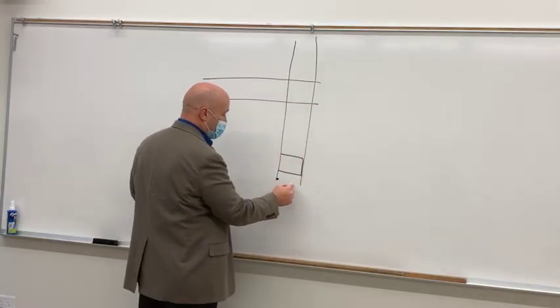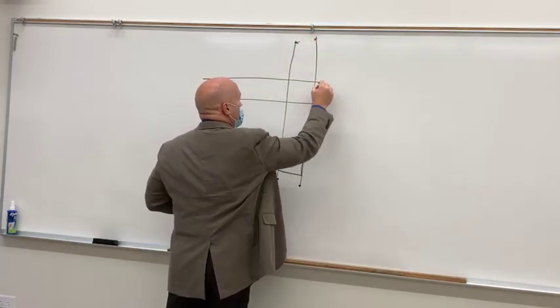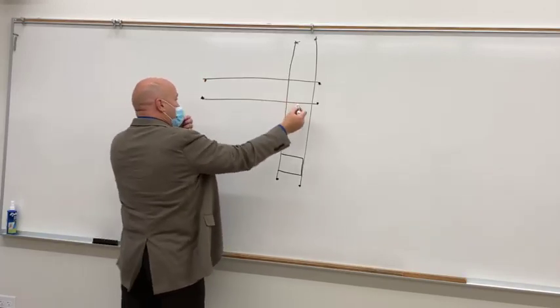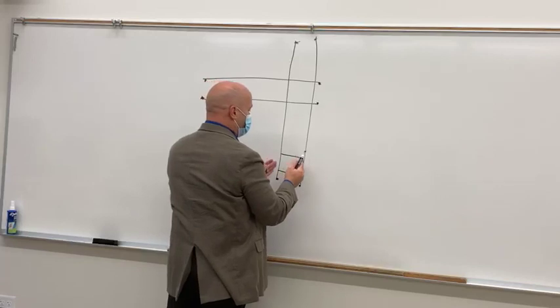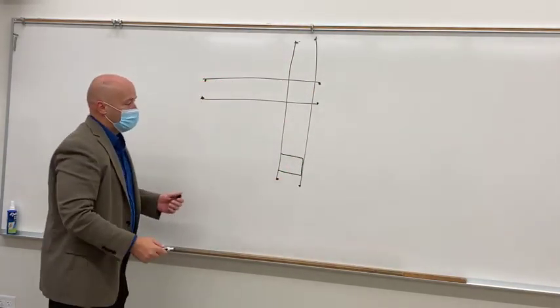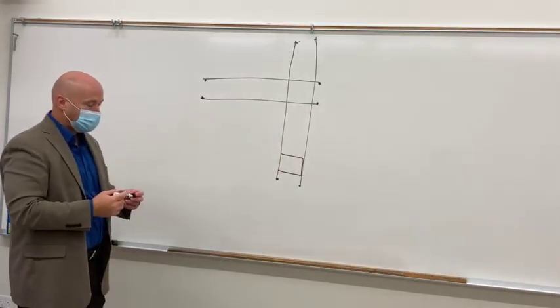So you got some stops here, some stops there, so you can't run it off the rails. Some stops here, some stops here. So you got wheels that run this set of rails just up and down the room this way, and you've got wheels that run your tower up and down the room in this dimension. So you can take that tower anywhere into the room, very flexible.